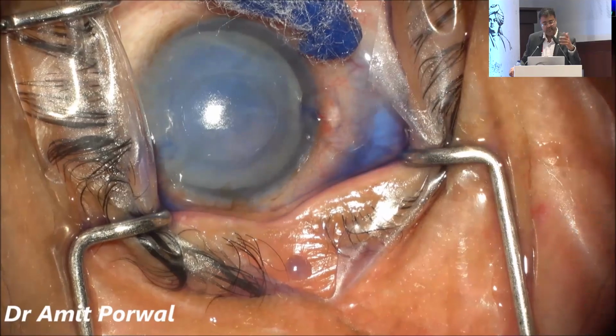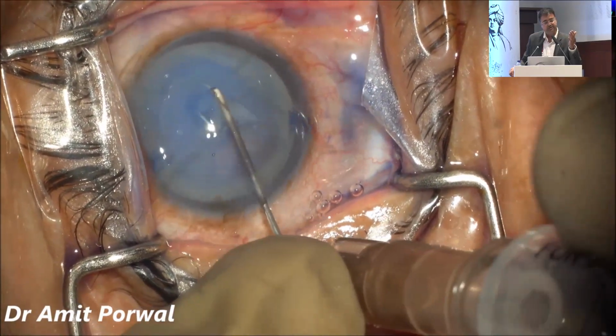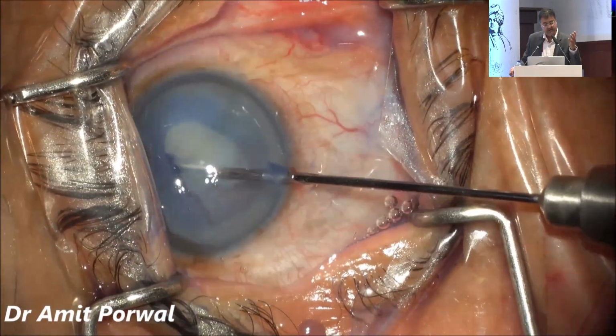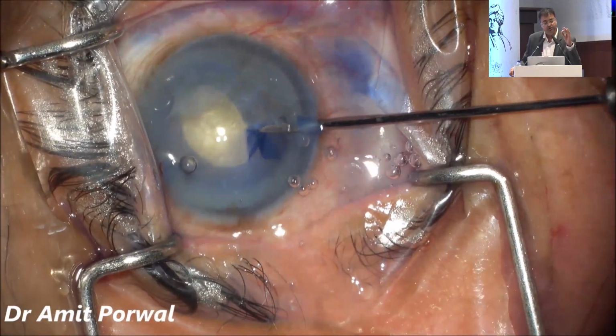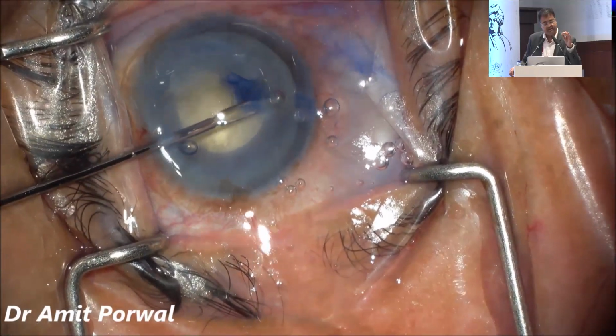Another thing, I'm aspirating it, but you saw it looked like intumescent, but not much fibrous material was aspirated. It was still convex only. So then start with the mini rhexis. These 25 gauge micro rhexis micro vannas are very, very important. You should have them in your cataract set. They are very delicate, you have to maintain them, but they are of great help.